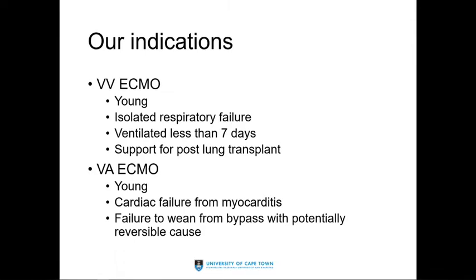We also use it for support for post-lung transplant. If you have primary non-function from the cold ischemic time and the reperfusion injury, transplanted lungs might not work effectively, and if you can rest them, they recover well.